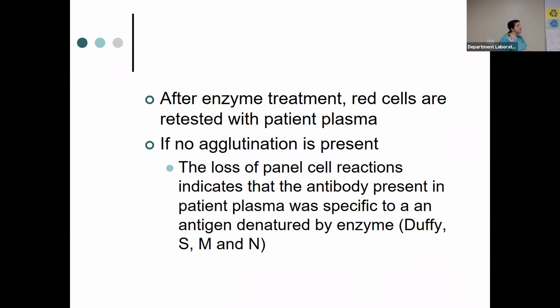If after enzyme treatment your reactions become stronger, what do you think you're dealing with? Rh, Kidd, maybe Lewis, all right? Not so often Lewis, but definitely your Rhs and your JKA and JKB.